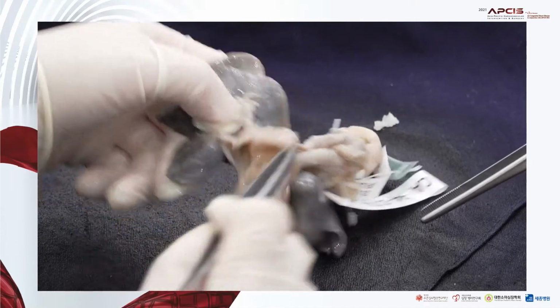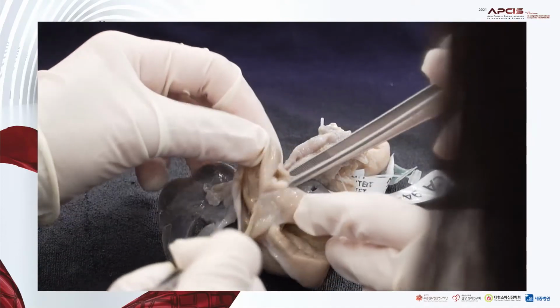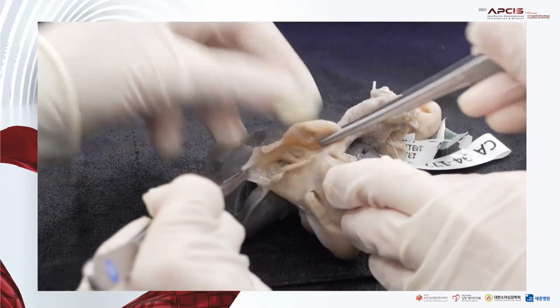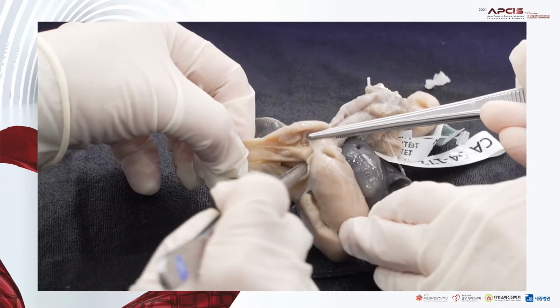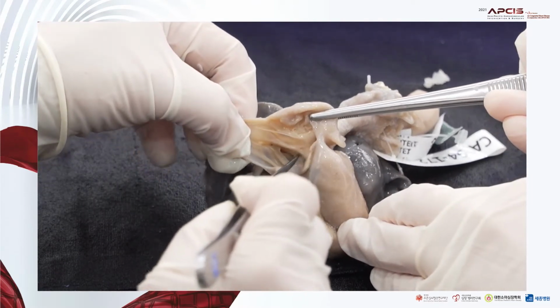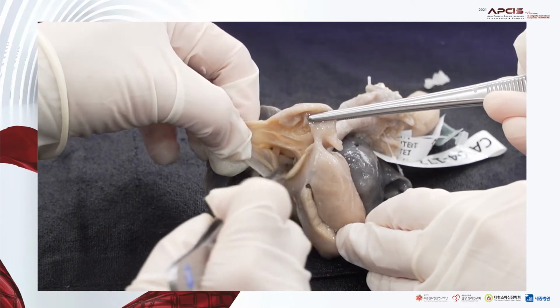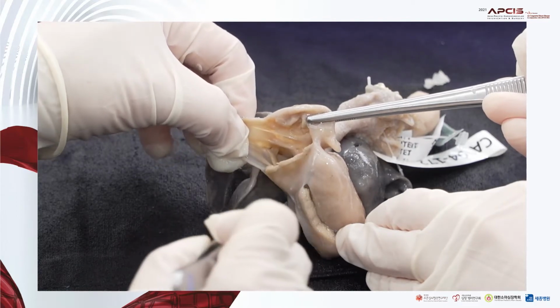And very big right atrium. And there is a foramen ovale. I think it is a rather big opening, so we can call it an atrial septal defect at this moment, like this.